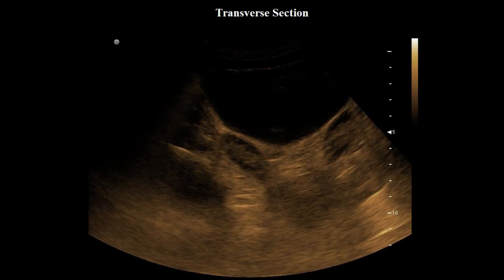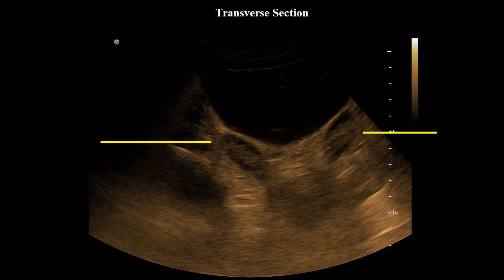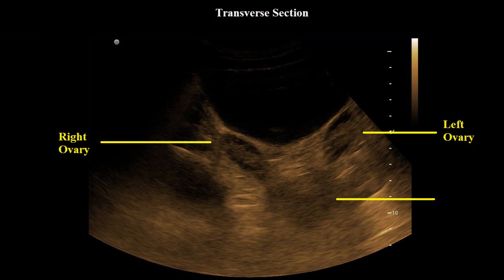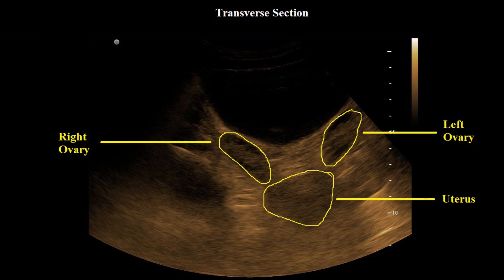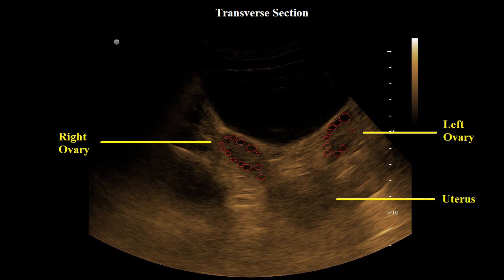Here you can see the transverse section of the pelvic region showing two oval hypoechoic ovaries and a centrally placed uterus. Multiple peripherally placed tiny follicles are seen on both ovaries.